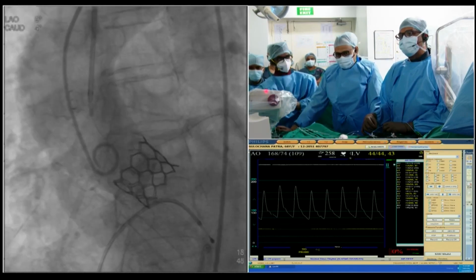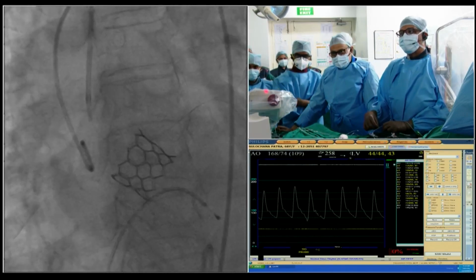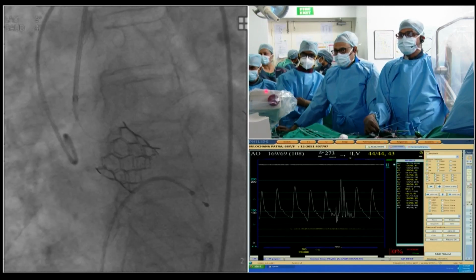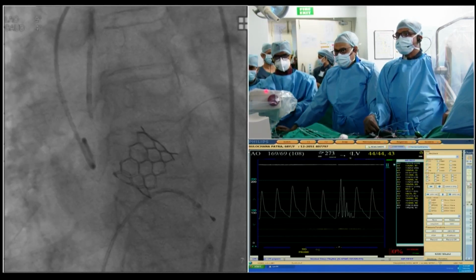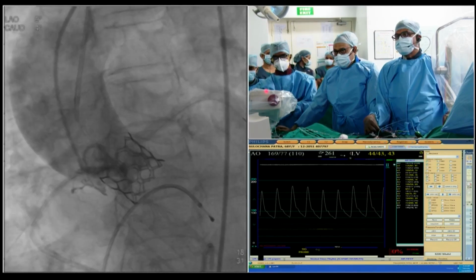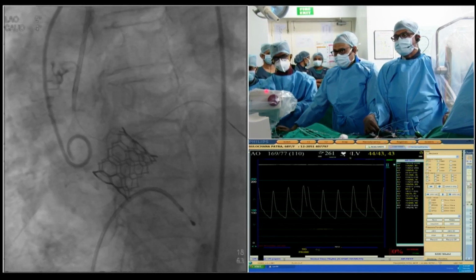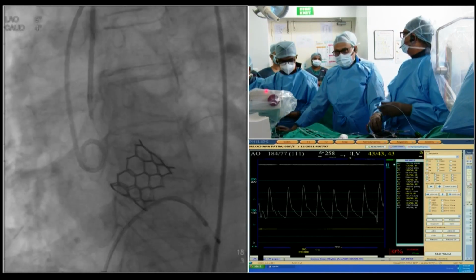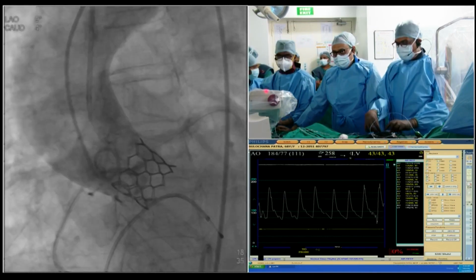With this injection, there looks to be something on the left main. Yes, it does look to be in the left main. So we are saying that the leaflet has maybe reached. If he pulls back the wire one more time, everything is going to get closed. So we would be okay with you if you are wanting to stent the left main. We'll go ahead and deploy the stent in the left main. We are going to stent right now.